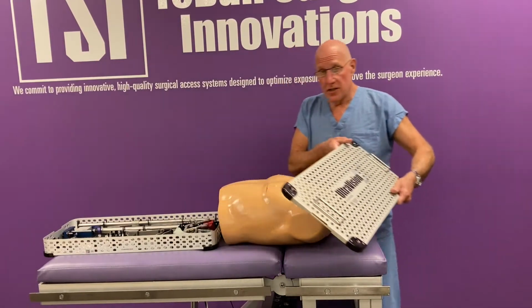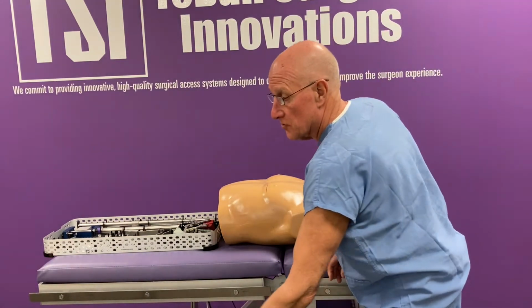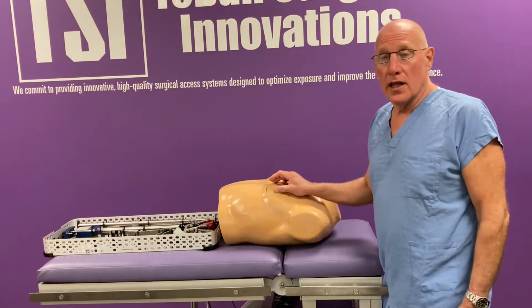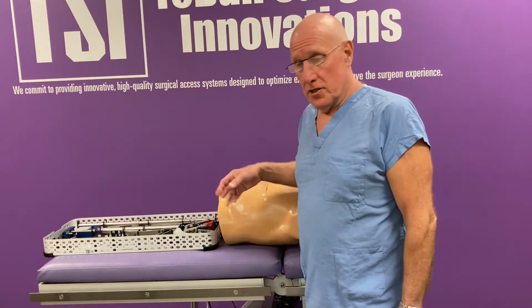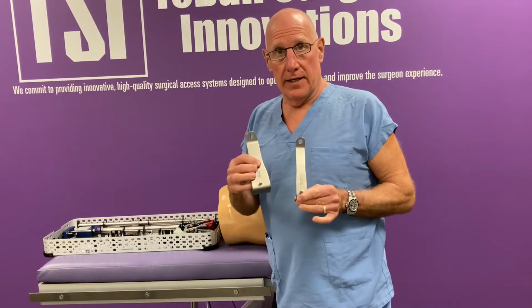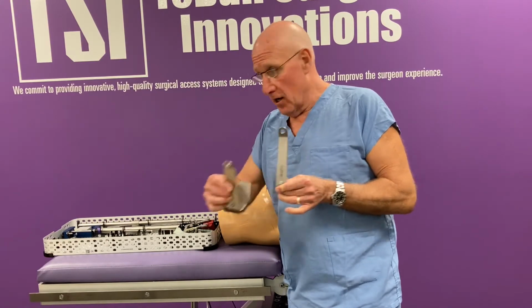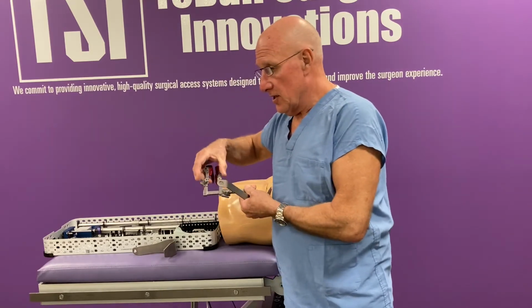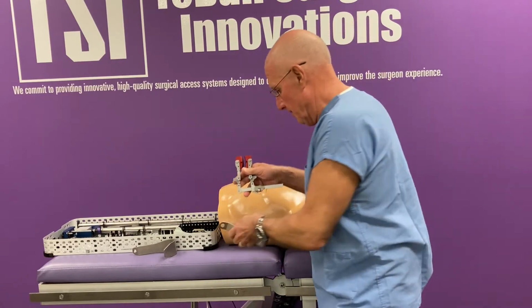This is the Ultravision CT lift system, and we're going to go through the setup of this system and use for a minimally invasive coronary procedure through a small left thoracotomy. So the setup for this procedure uses these IMA lift blades, and the IMA lift blades come in two sizes, wide or narrow, depending on your patient size. And it's going to be used in conjunction with the Ultravision CT surgical access system.